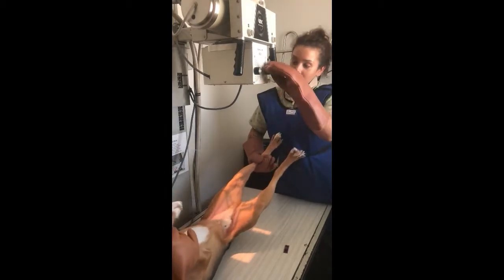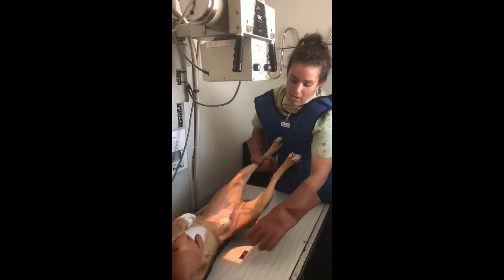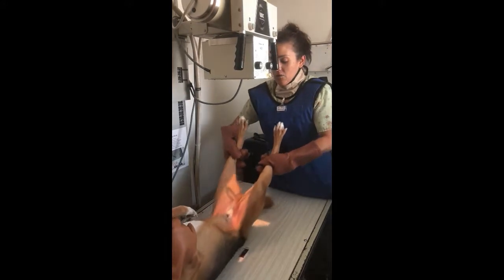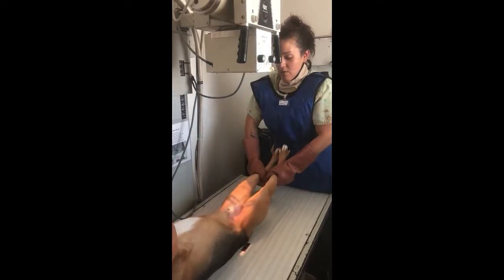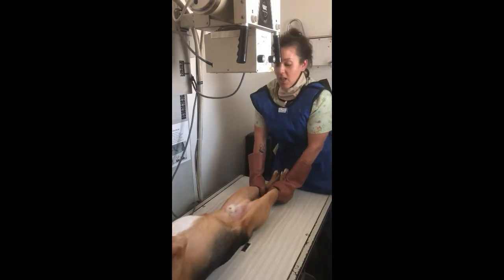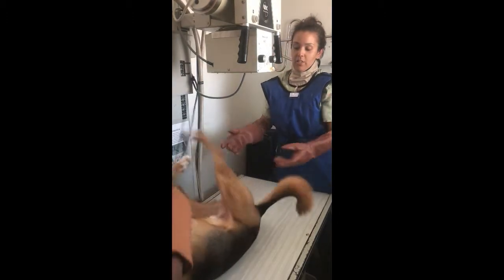And then we're going to set our collimation, put our marker. And what you want to do is you want to try to frog leg them first, rotate them in, and bring them down and together. And what that's going to do is give you perfect positioning. Hit the pedal. Once you hear the beep, then you're done and you can release your patient.